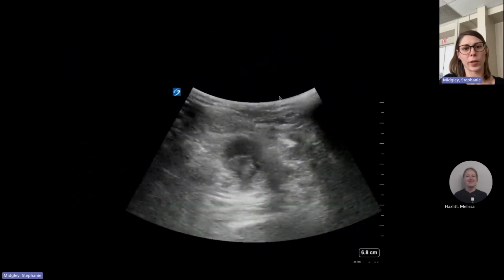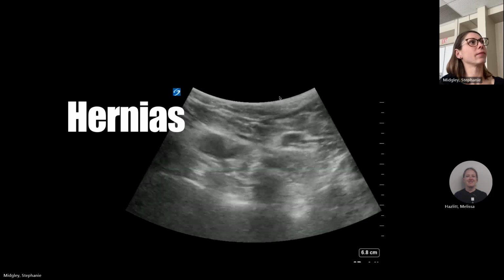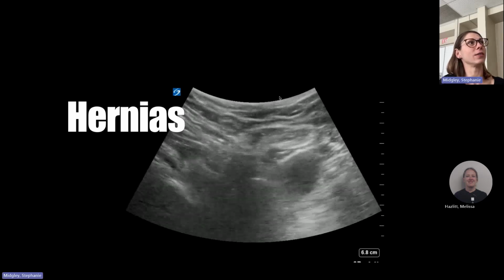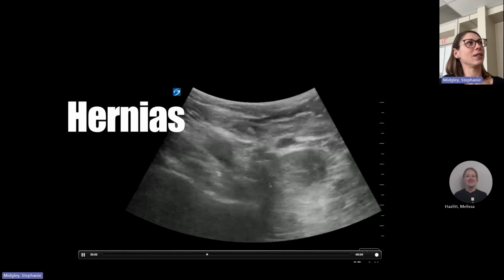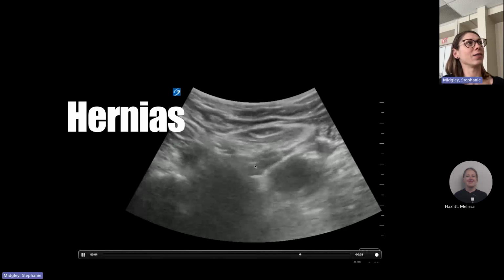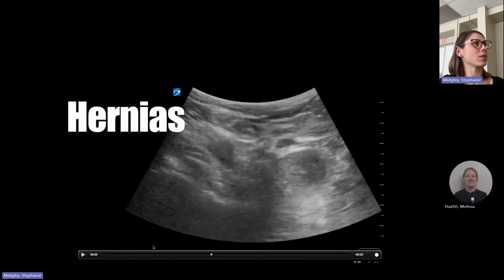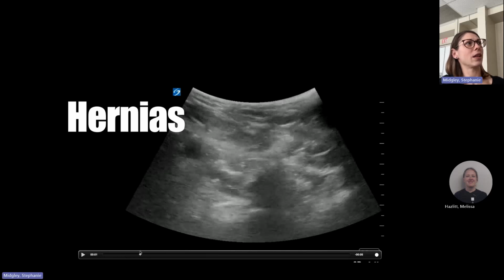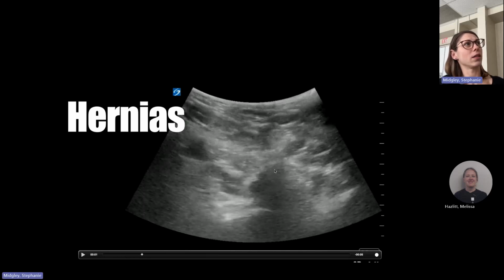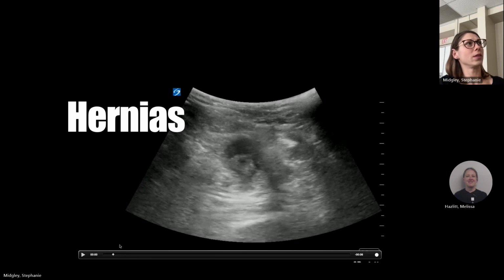All right, what do we got here? Oh, just kidding. Yes, this is actually your video. If you recognize it. But you can see right in here, that little stalk. Pause this and pull back. So you can see that defect coming from here as it comes up, and then you can see a loop of bowel right within that hernial sac.